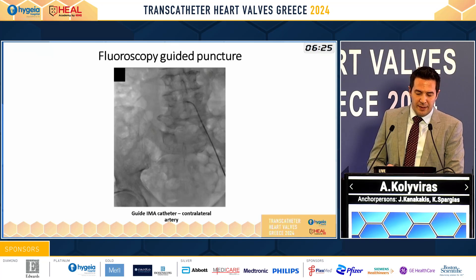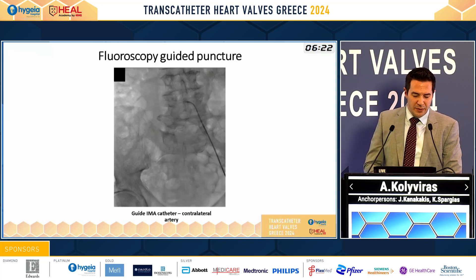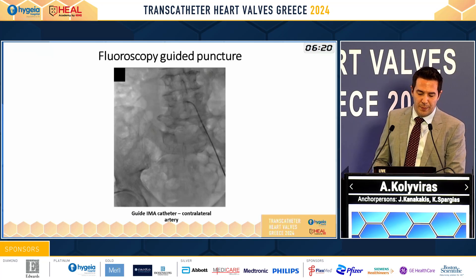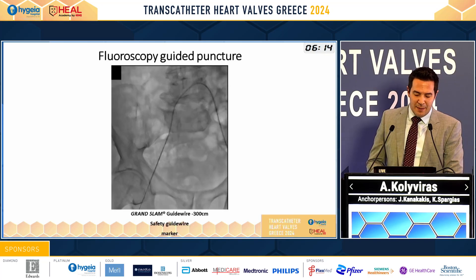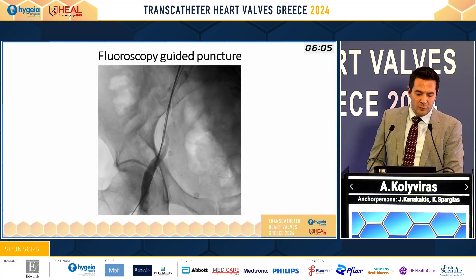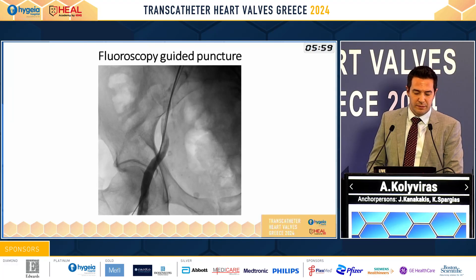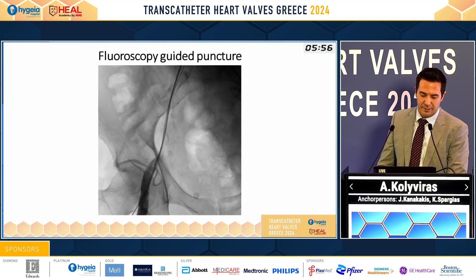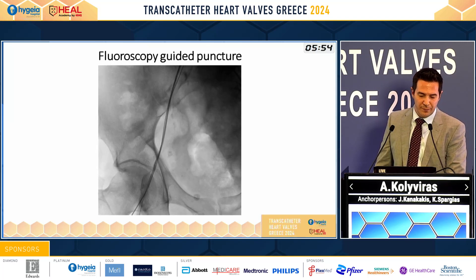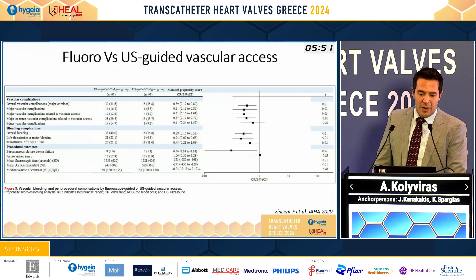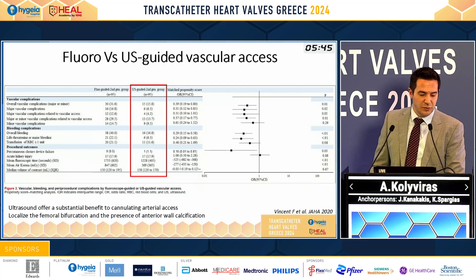If we use fluoroscopy, let's say we start our puncture on the right side. We have to place a guide catheter in the contralateral artery. We advance a Grand Slam guide wire or an Ironman — this is our safety guide wire and it serves as a marker. We make our puncture using fluoro, targeting the mid femoral head and the marker guide wire placed before. Our advice is to make all punctures under echo because using echo we have fewer vascular complications.